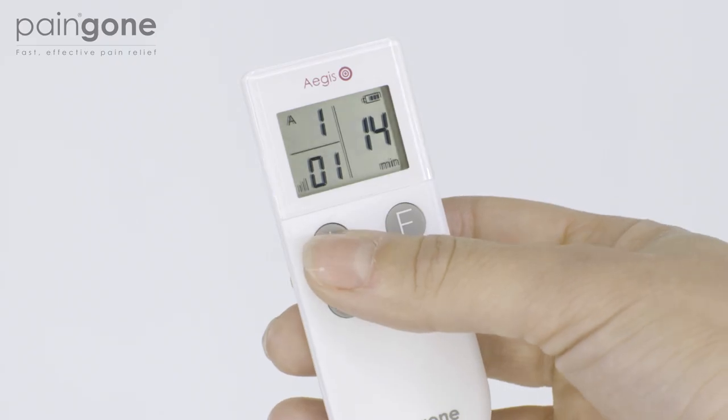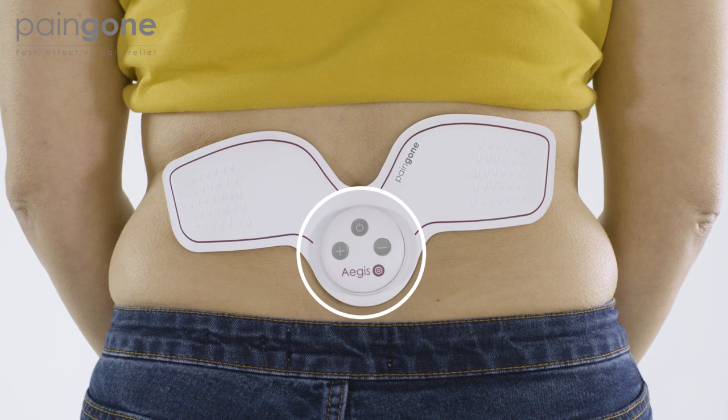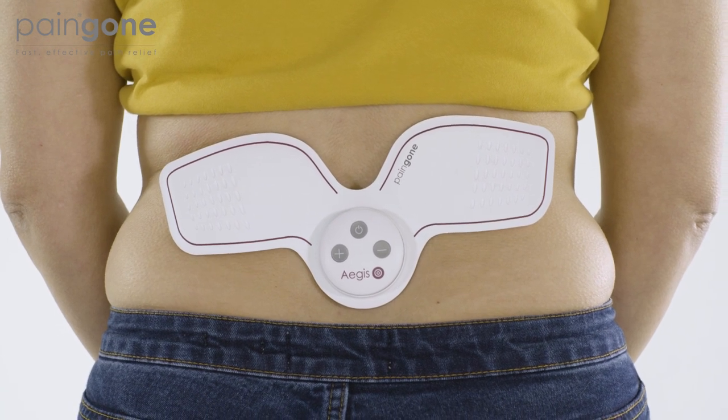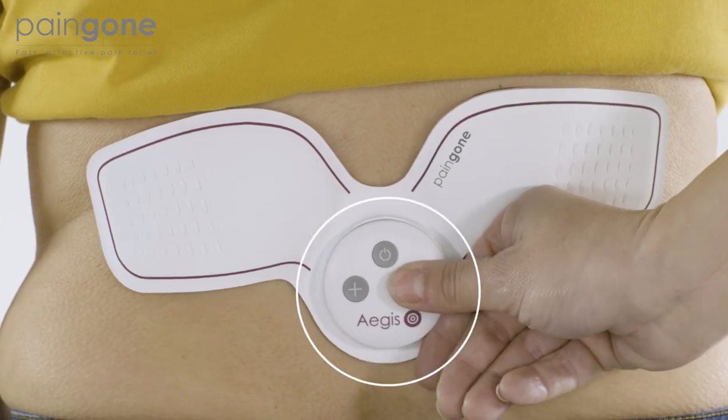Increase intensity to a level that is comfortable by repeatedly pressing the plus button on the remote or on the power unit. There are 16 levels of intensity. If the intensity becomes too strong, press the minus button to reduce the strength of the pulses.